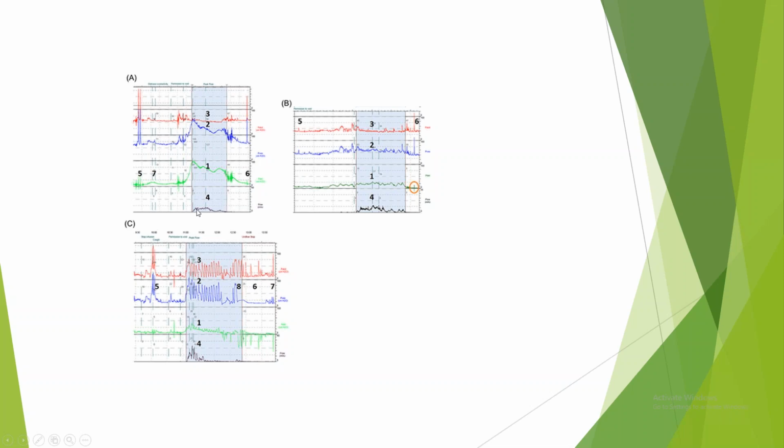Okay, so this graph is like incomplete emptying or slow emptying, and it may be because she may have some obstruction. See, if the detrusor pressure has not risen and the flow rate is less, it is detrusor hypocontractility. But if detrusor pressure is more, as in this case, but the bladder is emptying slowly, then it might be due to obstruction, because the bladder is trying to overcome this obstruction. That's why detrusor pressure is increasing, but she is not able to empty the urine. Got it?